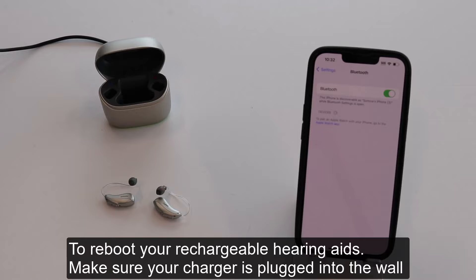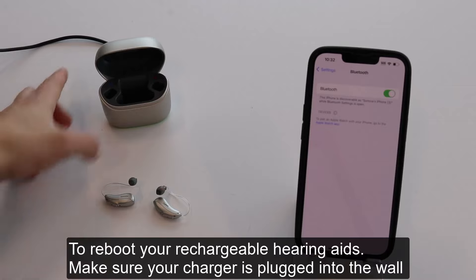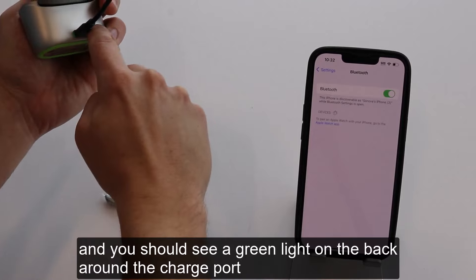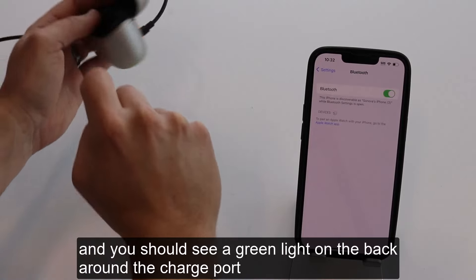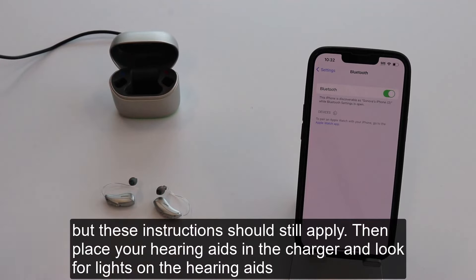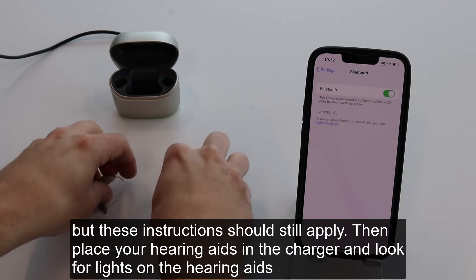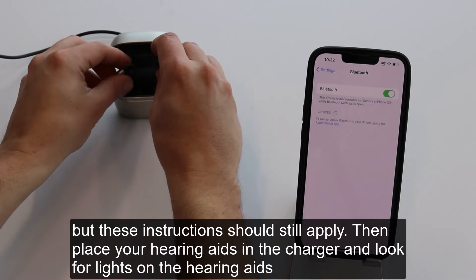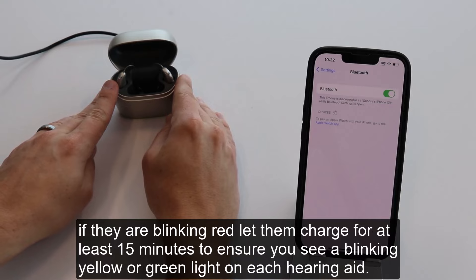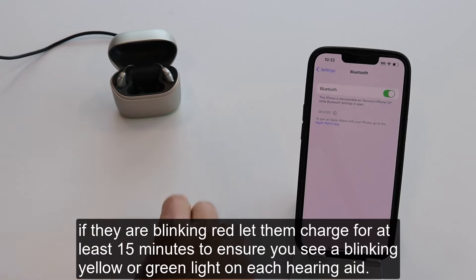To reboot your rechargeable hearing aids, make sure your charger is plugged into the wall and you should see a green light on the back around the charge port. Your charger may look slightly different, but these instructions should still apply. Then place your hearing aids in the charger and look for lights on the hearing aids. If they are blinking red, let them charge for at least 15 minutes to ensure you see a blinking yellow or green light on each hearing aid.